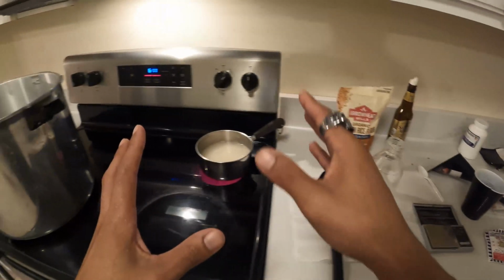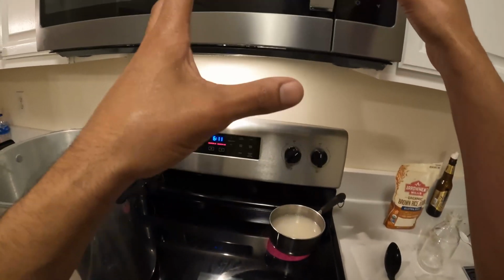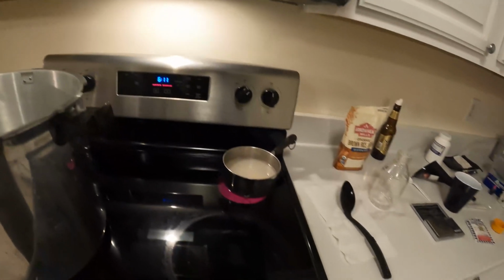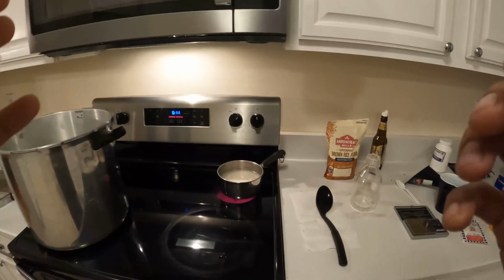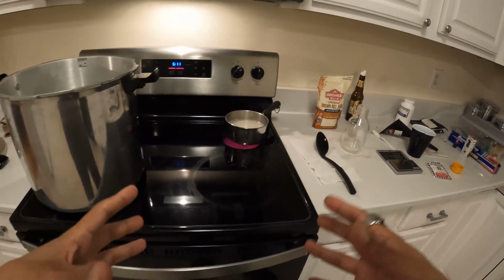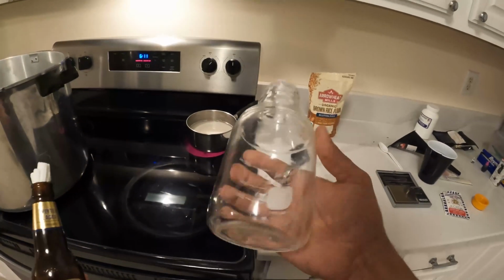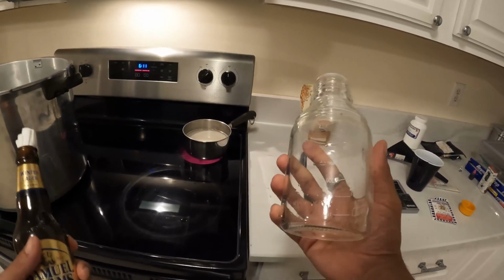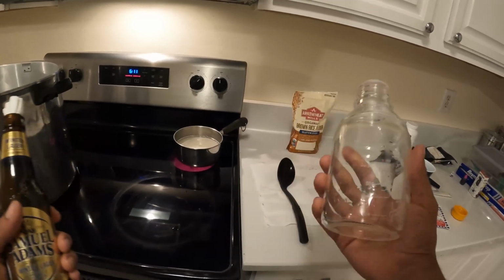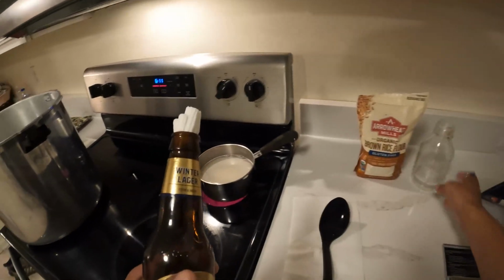So while that goes ahead and gets to a boil, we're going to start the microwave, and we'll just put it on 4 minutes and try to keep an eye on it. We'll do a little bit of multitasking so you guys can see both ways here. So say you don't have these flasks. I got these off of Amazon here. I paid about 18 bucks for one, and I think I caught them on sale. They had a sale for 2 or something, 2 for a better price, and I copped that.